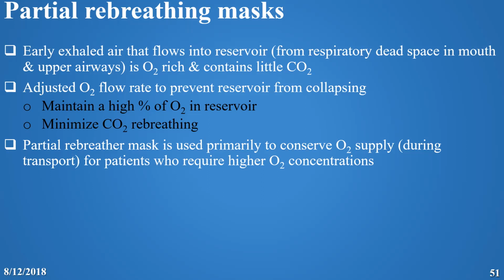So once the patient exhales, breathes out, that air in the dead space moves to the reservoir. The remaining air that was in the alveoli goes out because the reservoir is full. And once we breathe in, the air comes from the reservoir and from fresh air, and therefore it has minimum CO2.